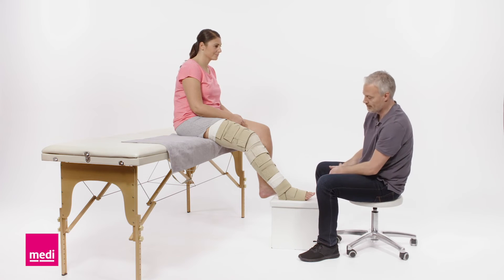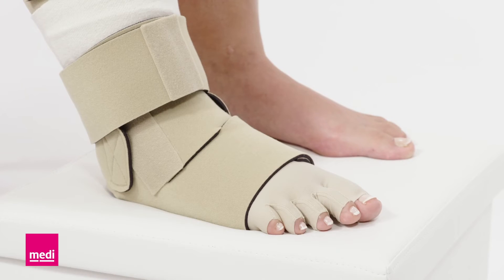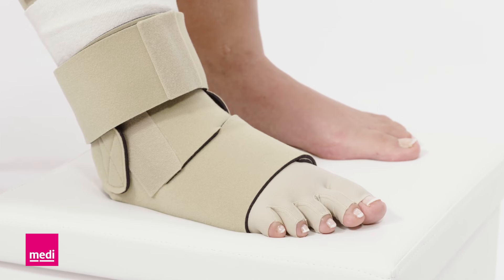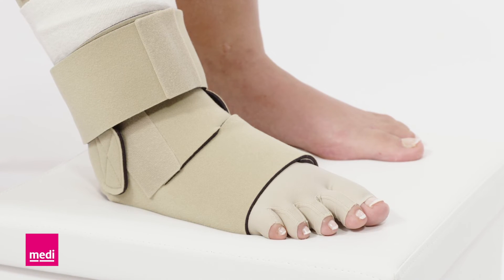For an effective therapy, readjust the compression throughout the day. If the toes also require compression, it is recommended that you also use the Circade Toe Cap. Make sure that it is worn underneath the ankle foot wrap.